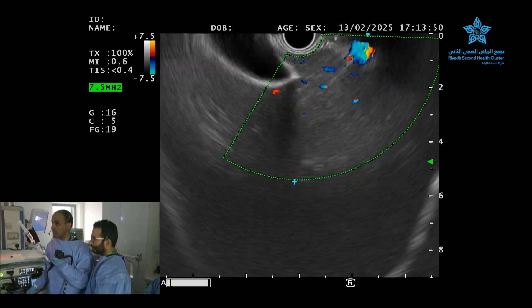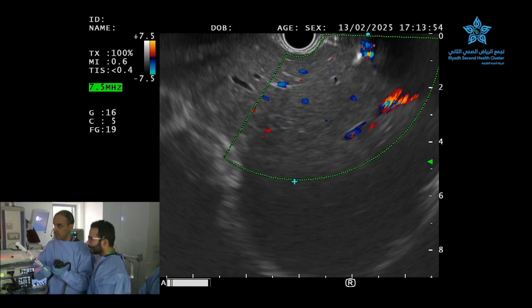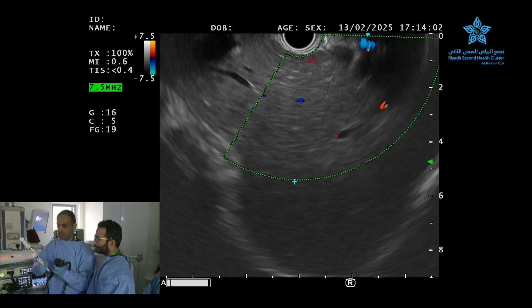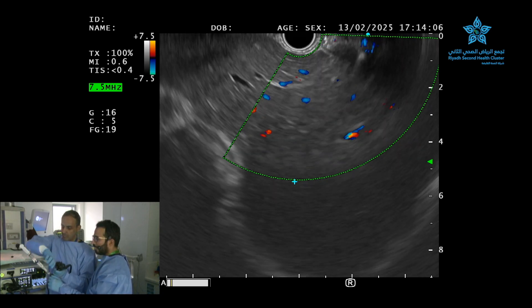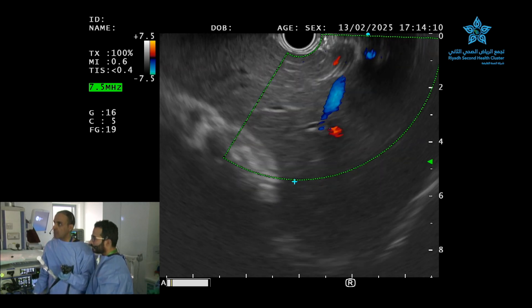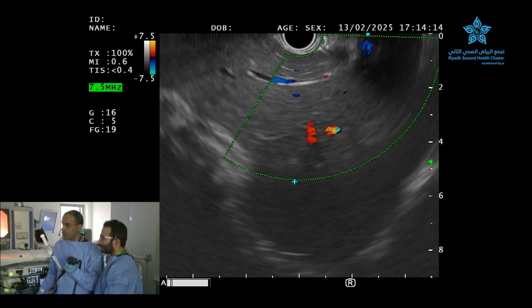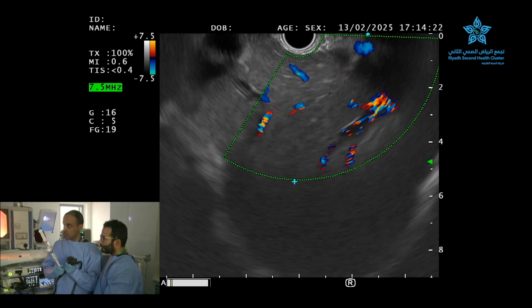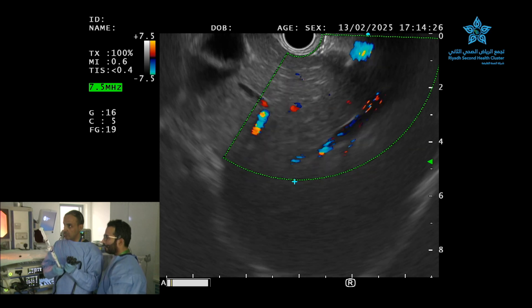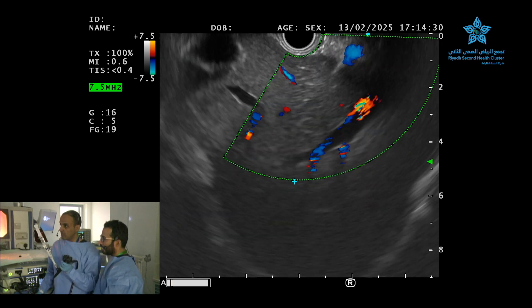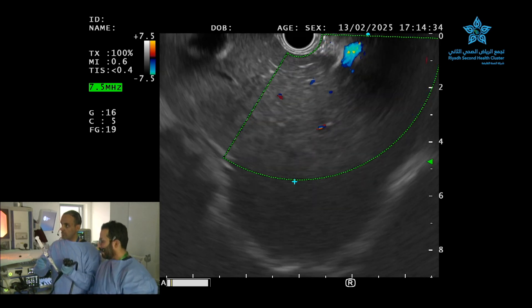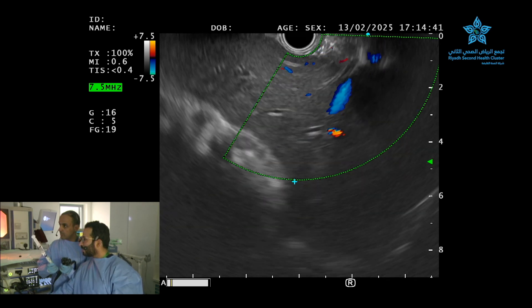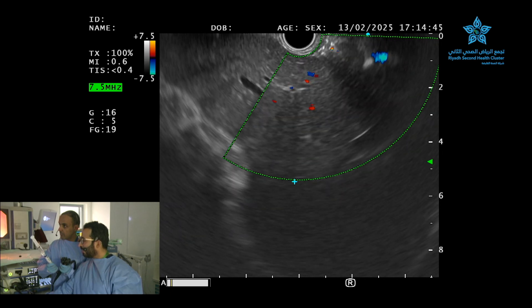We'll wait for the biopsy and then switch. We have the needle in place. We will unlock the needle. The tip of the catheter is visible and looks good — we can see the catheter at the tip of the echoendoscope. We are using a 19-gauge needle, standardized, as we're collecting prospective liver biopsy data. We confirm a good position. Before we stick the needle, we always go clockwise and counterclockwise just to make sure we are avoiding any vessels. That's a good position — we will insert the needle now.